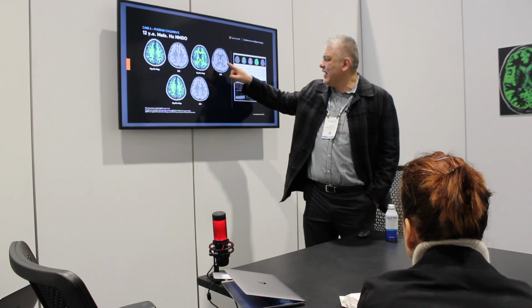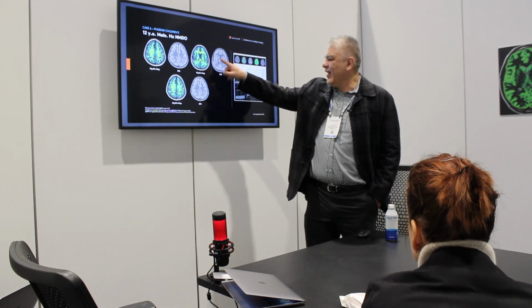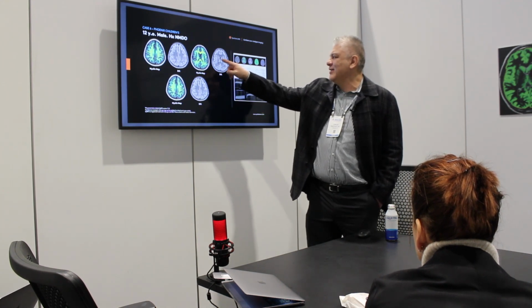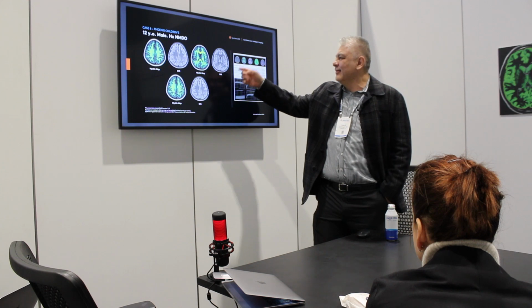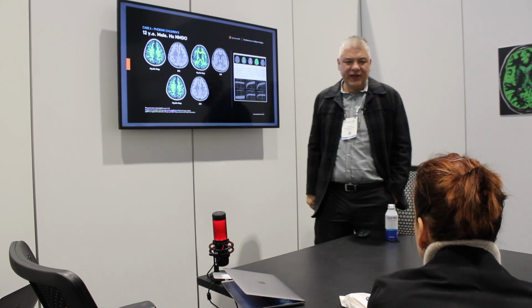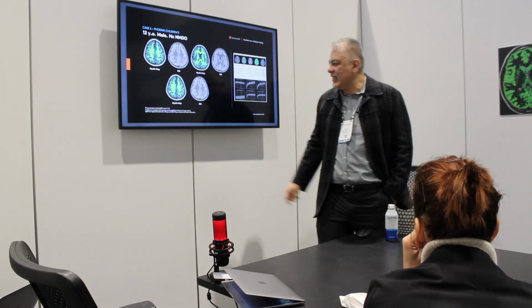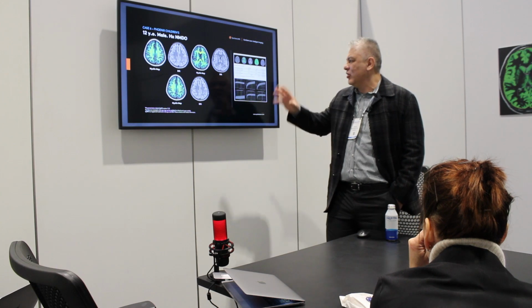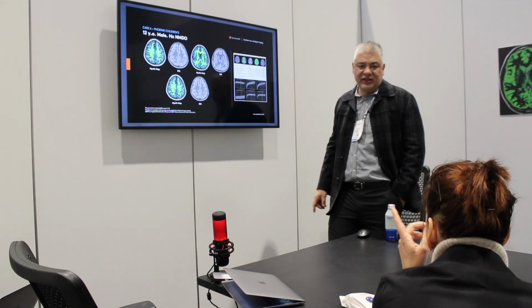And you can see these areas, for example, that on FLAIR you're like, well, I don't know, are those perivascular spaces? But you can see how objectively there is all this decreased myelin in the periventricular white matter. So you can see the areas, and you can see how all the brain has actually decreased myelin in this patient with neuromyelitis optica.